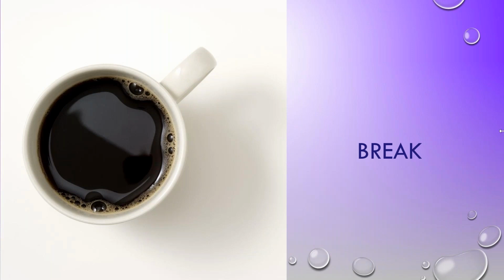But the other thing is that when we go back onto the BVM to bag the baby, what we see is that we then do it quite vigorously because now the saturations are very low. And that is where we see a lot of barotrauma, shearing trauma, that sort of thing happening.